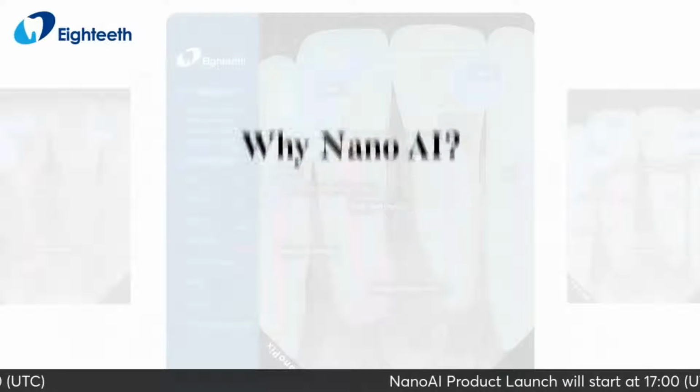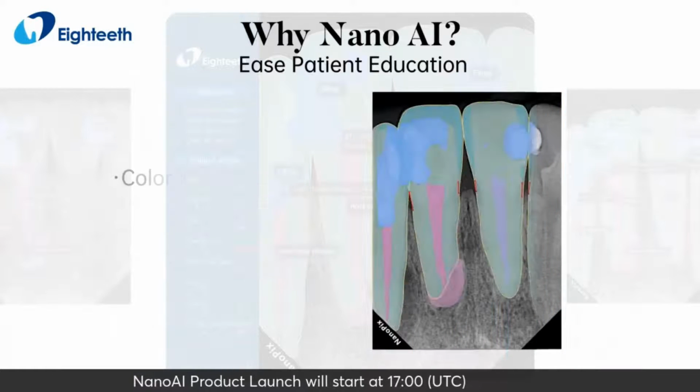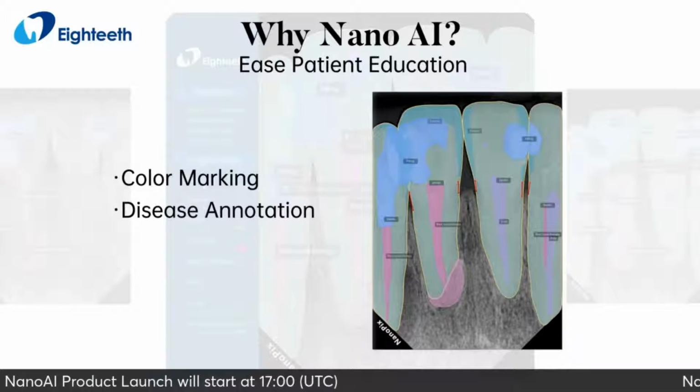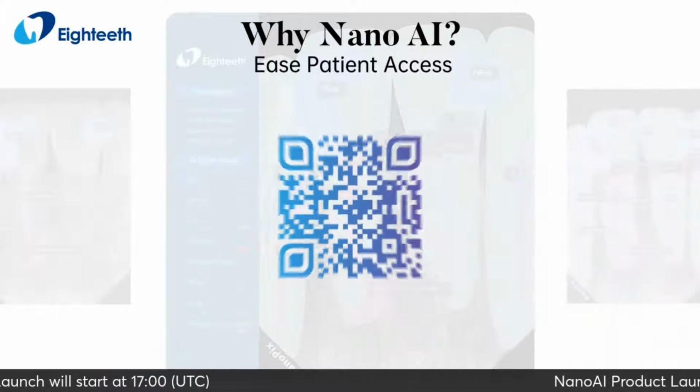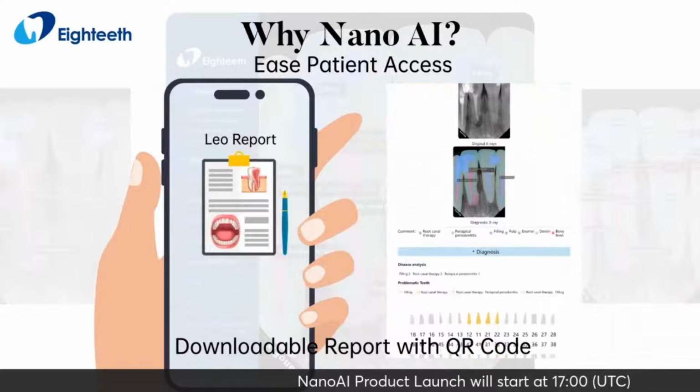Why NanoAI? NanoAI can ease patient education through color marking and disease annotation. It also can ease patient access. Patient can download report with QR code.